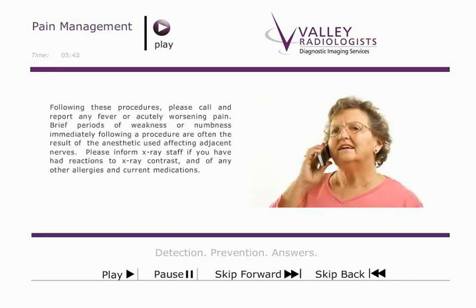Following these procedures, please call and report any fever or acutely worsening pain. Brief periods of weakness or numbness immediately following a procedure are often the result of the anesthetic used affecting adjacent nerves. Please inform the X-ray staff if you've had reactions to X-ray contrast and of any other allergies and current medications.